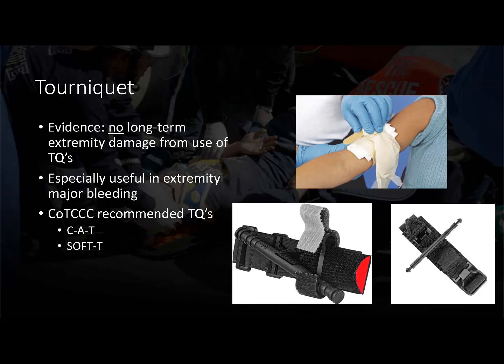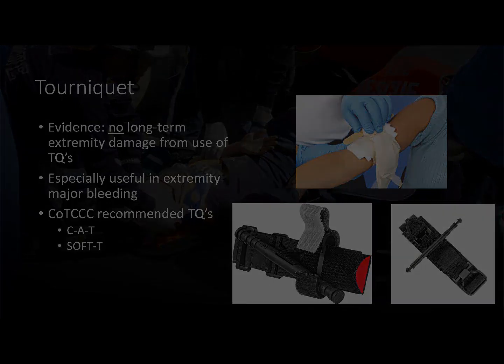Unfortunately, because they're a little bit less expensive and they're retailed on major retail websites online, they're prone to be purchased by individuals who maybe don't have a big budget and by departments who are also facing budget crunches. Tourniquets like these have been purchased by fire departments, used by first responders and others on scene. In those instances, tourniquets were applied to actual bleeding patients whose life depends on the tourniquet working, and the tourniquet failed. Let's look at this story from the CBS Evening News discussing counterfeit tourniquets and a bulletin that was put out after an actual event occurred in New Hampshire.